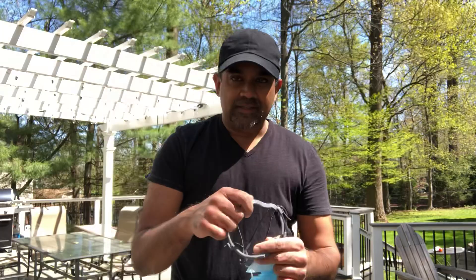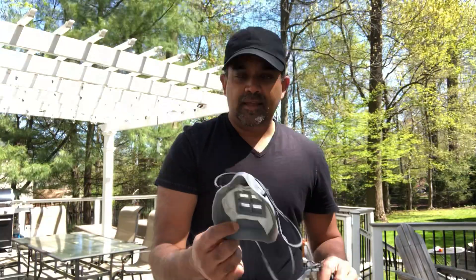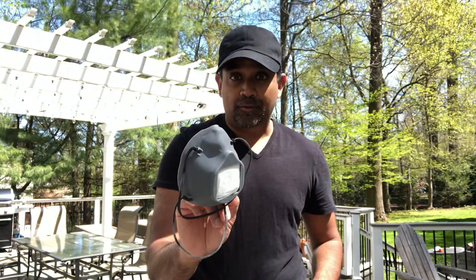We've been busy at work printing these Bellis 3D mask fitter frames and also these custom-made N95 Montana mask DIY respirators. The whole point of this is to help healthcare workers that don't have access to really good PPE yet — that's personal protective equipment.